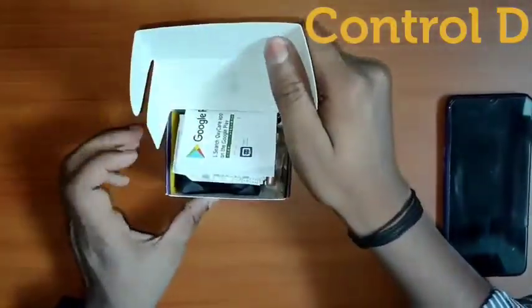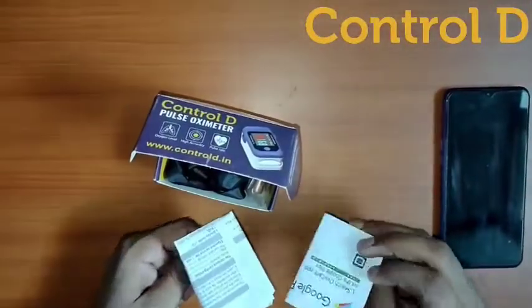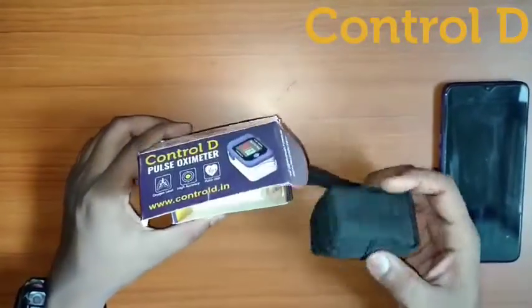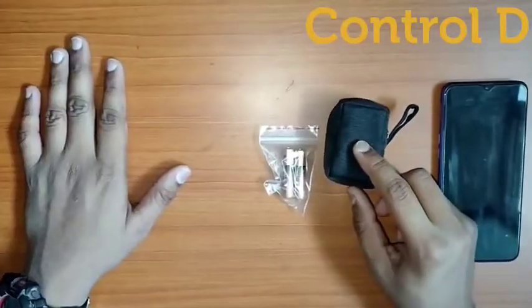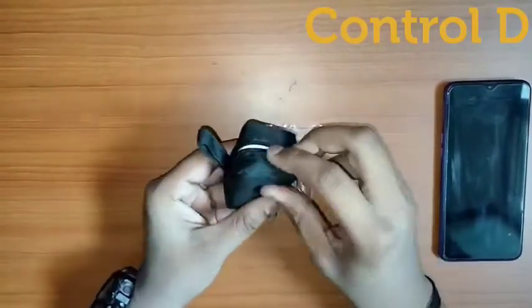Let's open the box and find the stuff inside it. You will get some manuals, a ribbon, and a black box. Keep it aside and take the two AAA batteries from it. Now you just need to remove the covering of the black box.